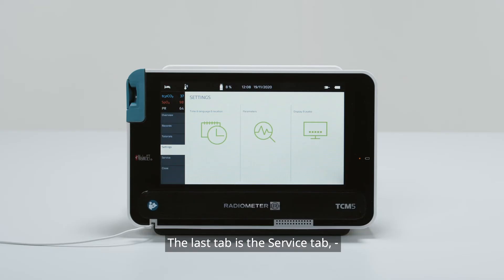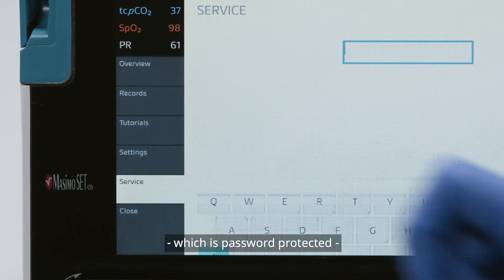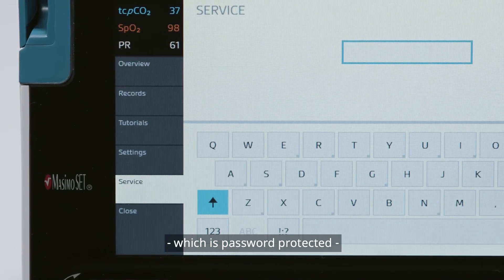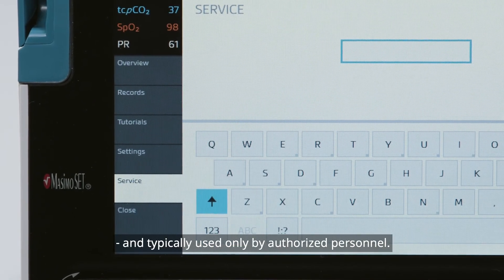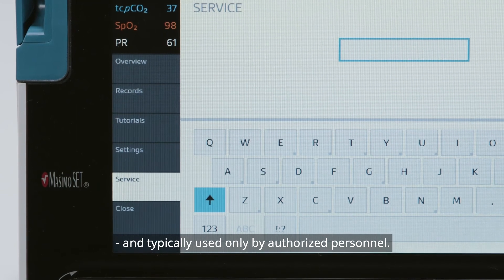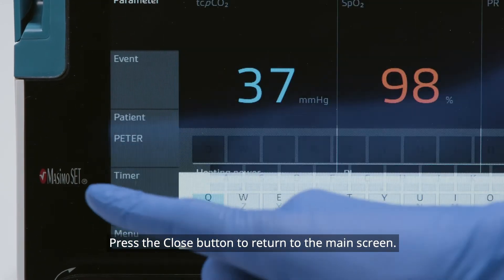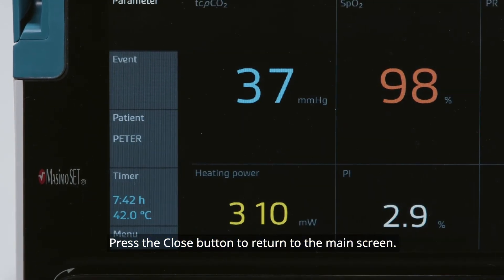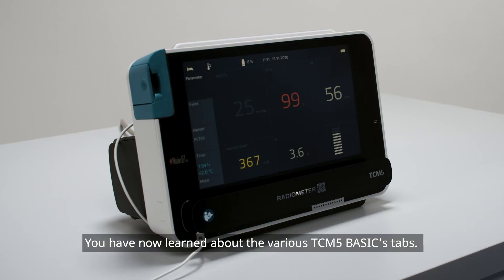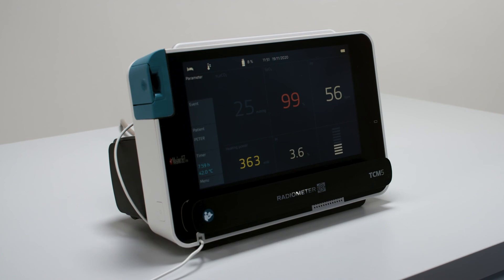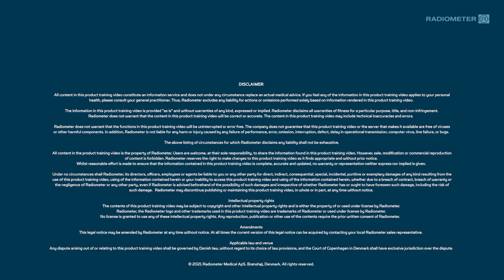The last tab is the Service tab, which is password protected and typically used only by authorized personnel. Press the Close button to return to the main screen. You have now learned about the various TCM-5 basics tabs.